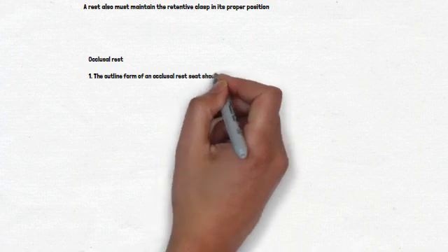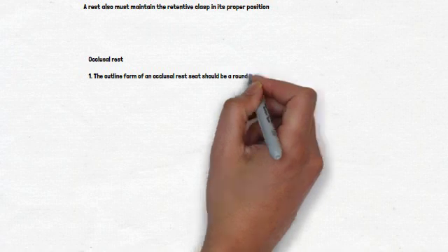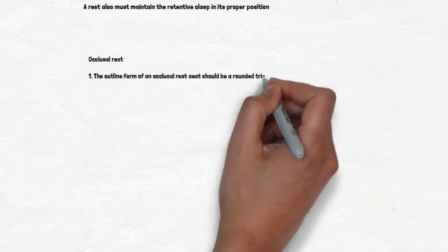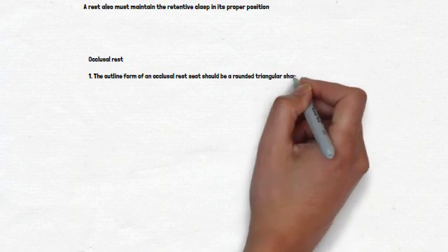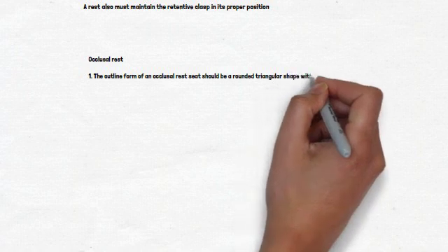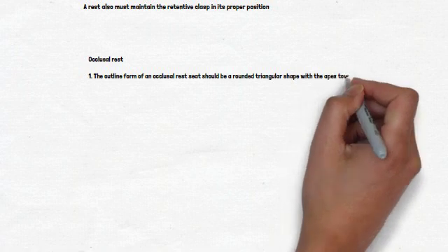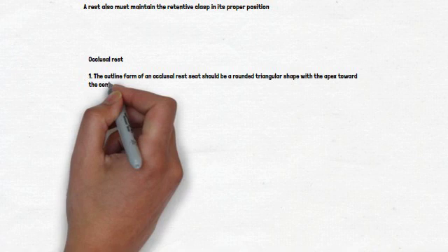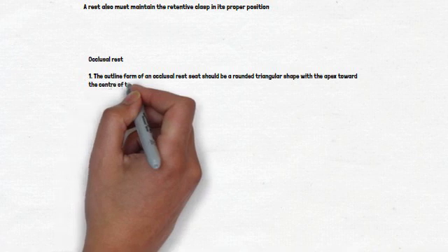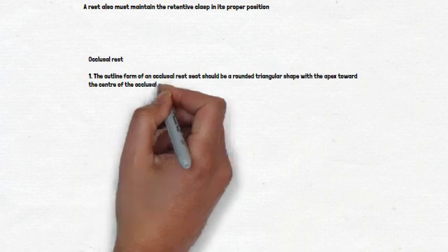An incisal rest seat is prepared in the form of a rounded notch at the incisal angle of a canine or on the incisal edge. The notch should be beveled both labially and lingually, and the lingual enamel should be partly shaped to accommodate the rigid minor connector connecting the rest to the framework. An incisal rest seat should be approximately 2.5 mm wide and 1.5 mm deep so that the rest will be strong without having to exceed the natural contour of the incisal edge.